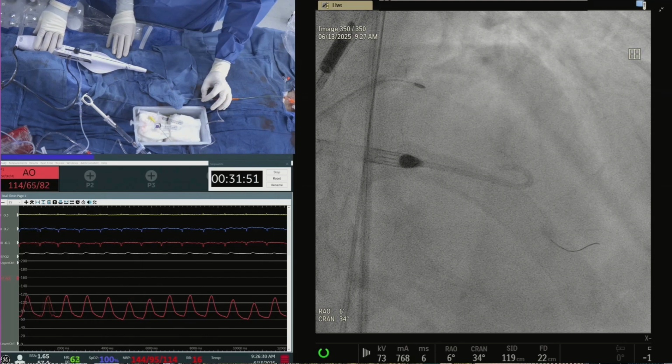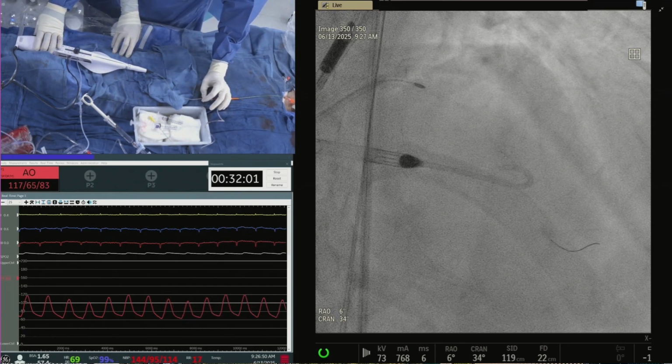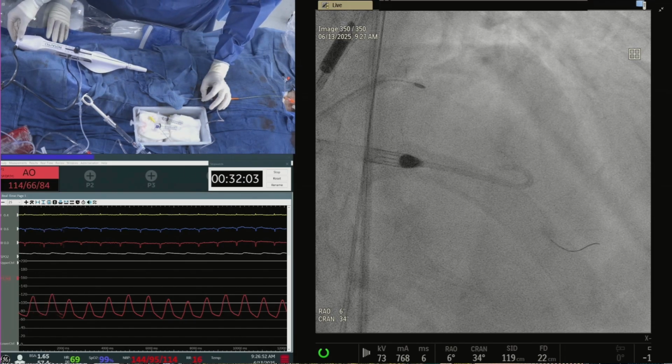Now, you see the second lesion also, we are having a difficulty in the diagonal. So that is where we have to be cautious. Diagonal at that level, risk of perforation. We have done a partial, maybe a few millimeters into that lesion. Do we just leave it or do we go ahead and complete it? So we went higher speed.